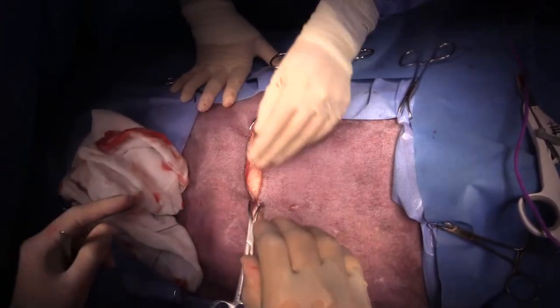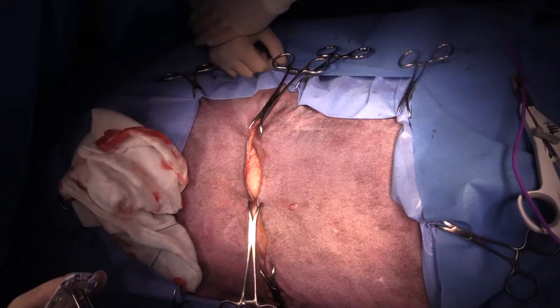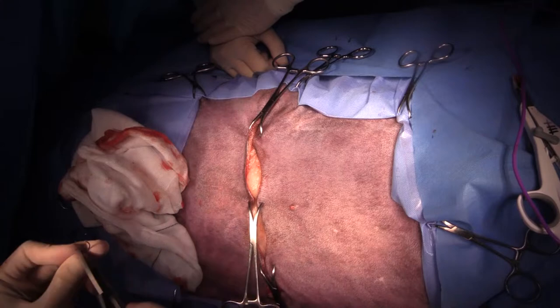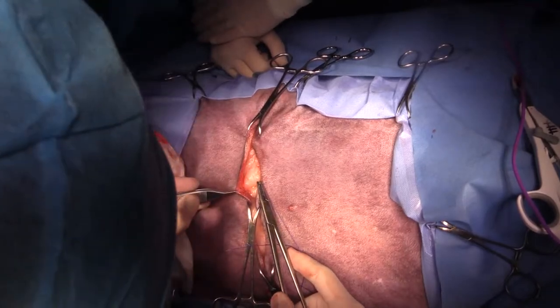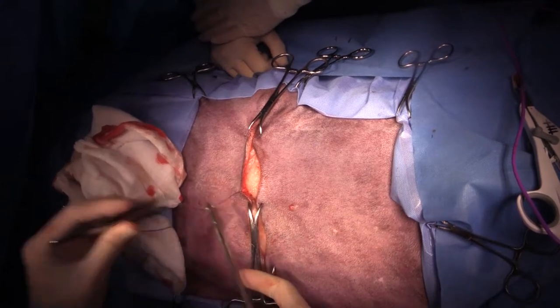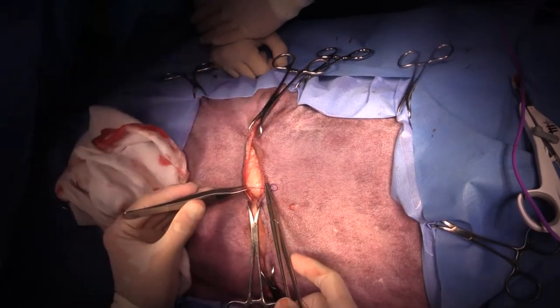Just leave that for a second. Start placing some sutures in here. I think that given the tension that this is under, the sub-Q fat would just tear anyway. So I'm just going to do an intradermal suture pattern tacked down to the underlying tissue. And I'm not going to put a drain in this. It's not necessary. It's under too much tension.